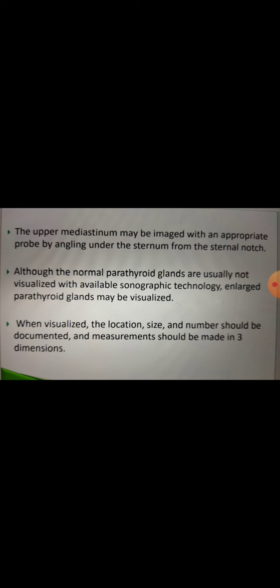Although you can visualize the enlarged parathyroid glands. Whenever you see an enlarged parathyroid gland, you should note the location, the size and number, and document them, and you should also take the measurements in three dimensions, just like we studied in the thyroid gland.